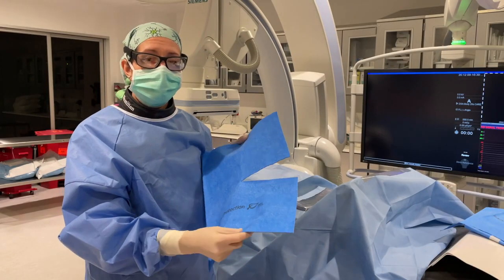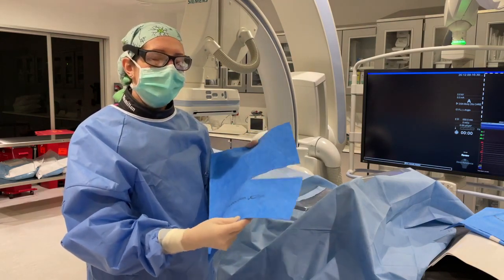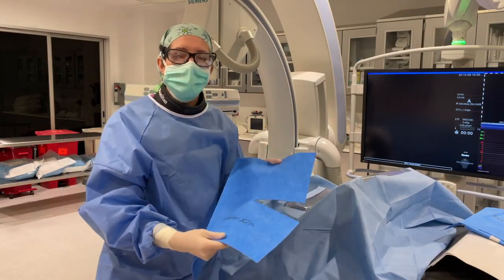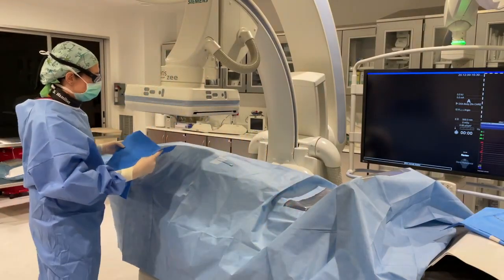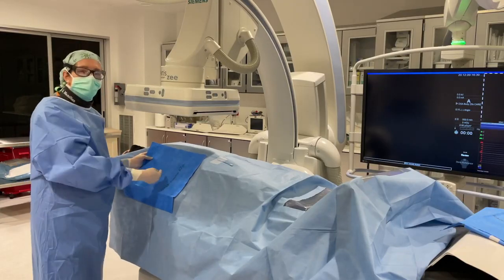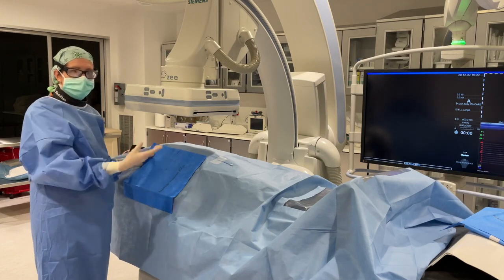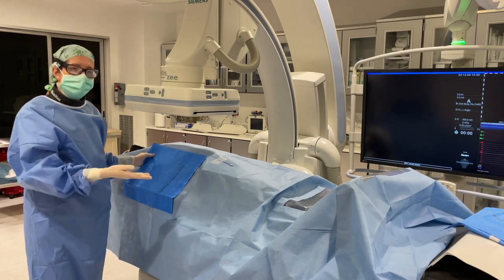You can use this fenestrated RADPAD to help you in percutaneous abdominal procedures. For example, in a biliary drainage, you can place this on the patient's right side after you enter the hepatic capsule with the needle, and then you can work through the fenestration of the drape to achieve the case and get access while achieving scatter protection.